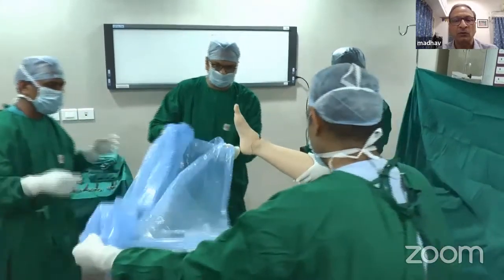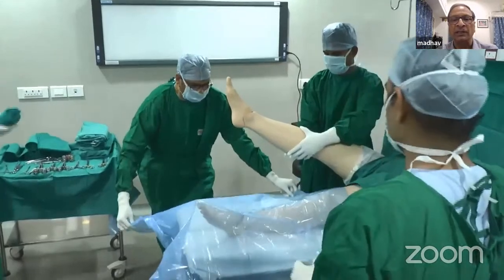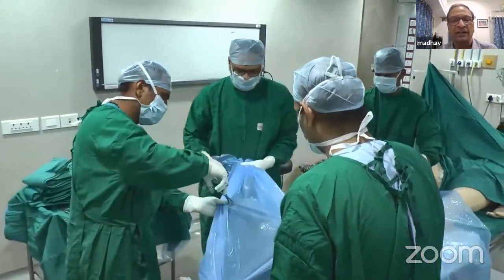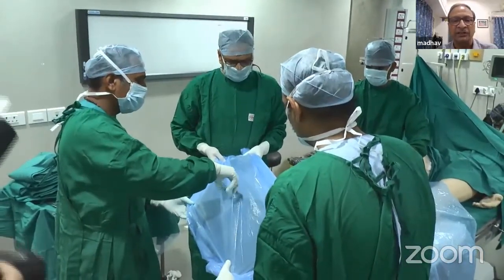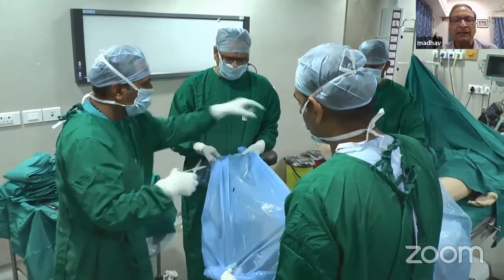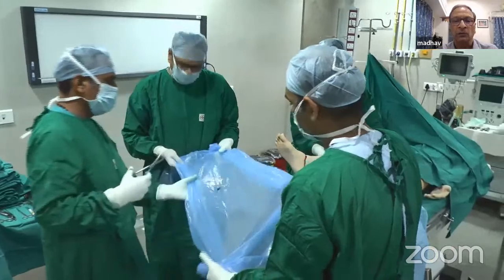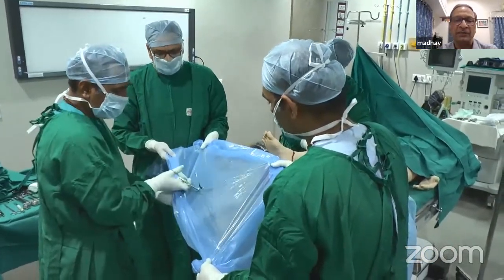The first thing that you do is take a plastic sheet. The assistant, as you can see, is holding the leg somewhere just below the knee. The first sheet goes under the leg. For the second sheet, you make a small cut or a slit in the sheet, and then you thread the leg or the foot through the small hole or slit that you have made in the plastic sheet.